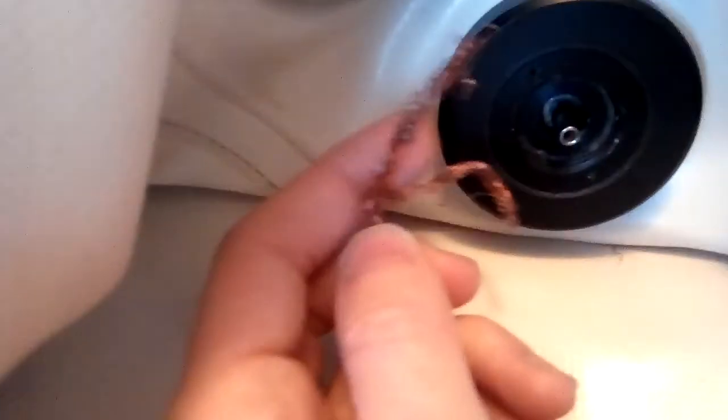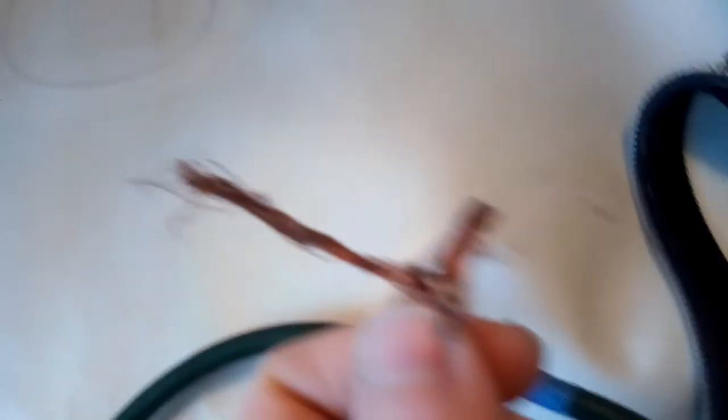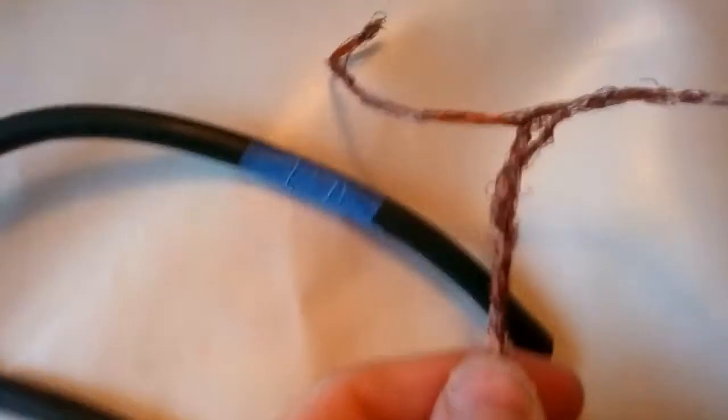I connect this to the oxygen on the inside, the oxygen line. I have to tie this a certain way. So I take this cord, which normally, give me 1 second. I take the cord, I'm going to separate it. Okay. So I separate it like that.